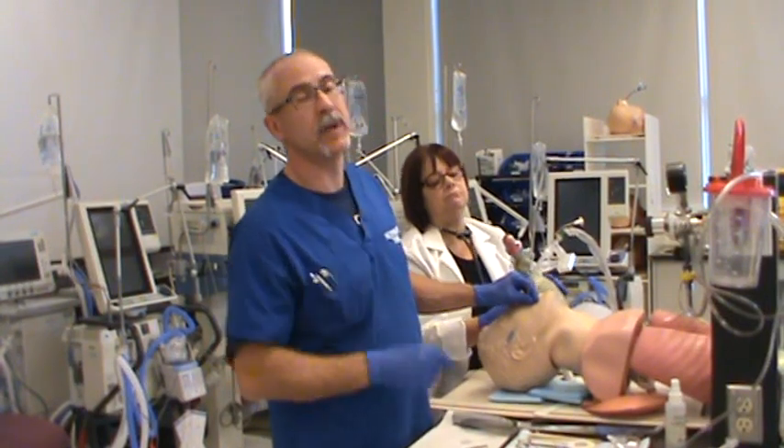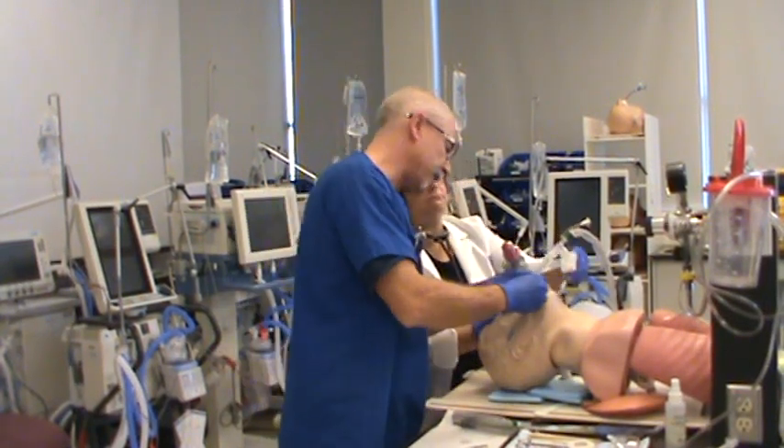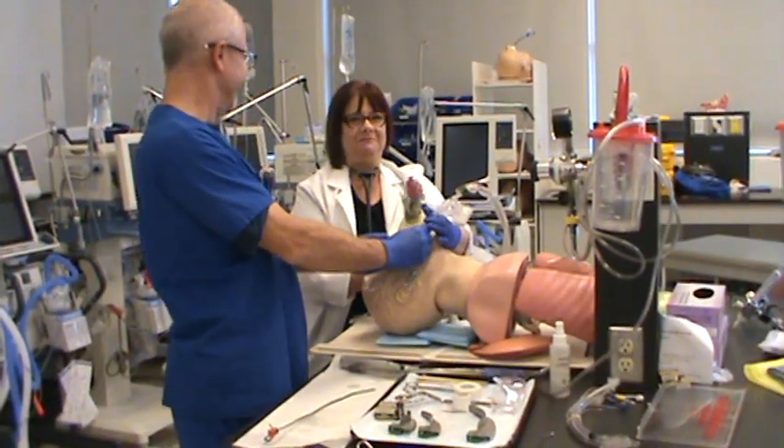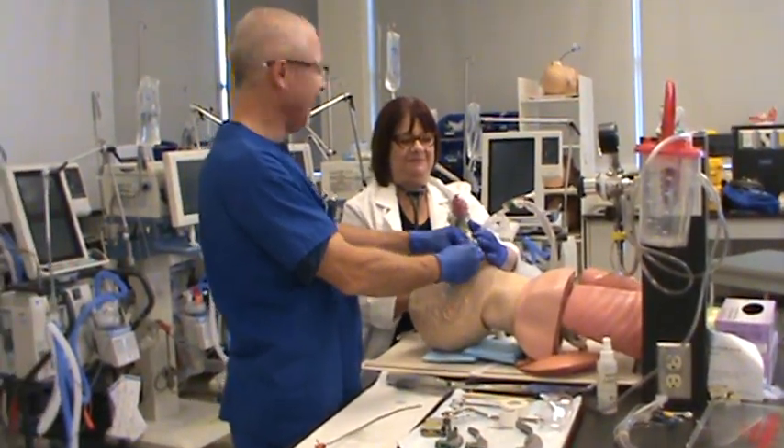The tube's in, now we need to secure it in place. Before that, I'm going to confirm that it's at 21 — and it's still at 21 at the patient's teeth.